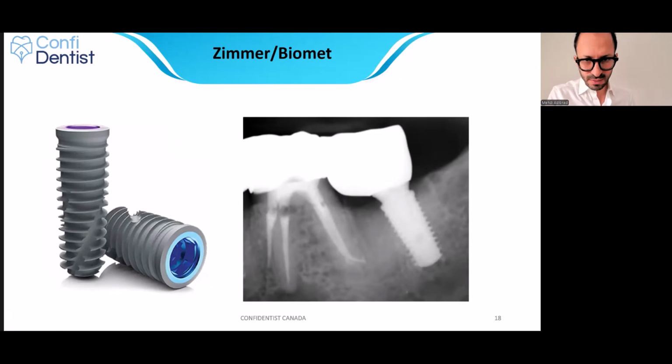You can see, yes, as I said, this is the implant platform, prosthetic platform. Apical to that, I have 1 millimeter, very narrow micro threads, and the rest we have macro threads. Very obvious. You can't go wrong with this implant. Take a look at this step. I have platform switching. Look at the extraction socket. Okay. No evidence of pre-implant bone loss.